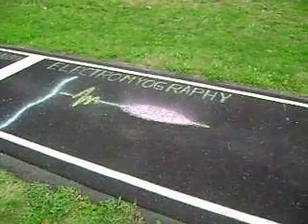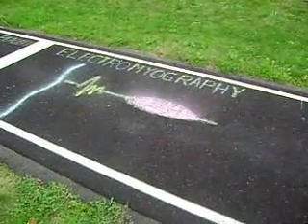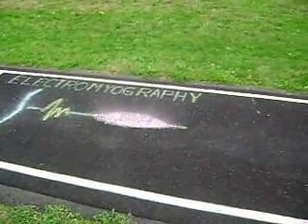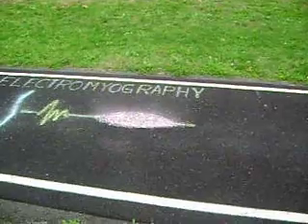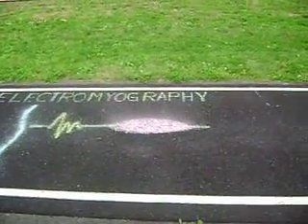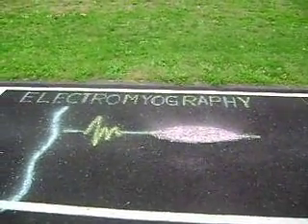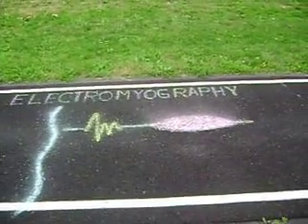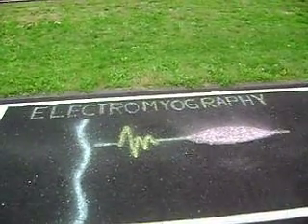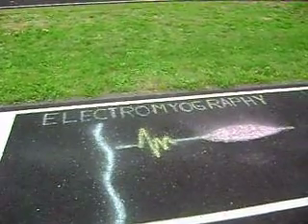The F wave is a muscle action potential resulting from a supramaximal stimulus of a motor nerve that leads to an antidromic action potential that reaches the alpha motor neuron and then to generation of a second orthodromic action potential. An F wave is recorded as a low amplitude muscle action potential occurring after the initial CMAP, an M wave, and is a means of evaluating proximal motor nerves.